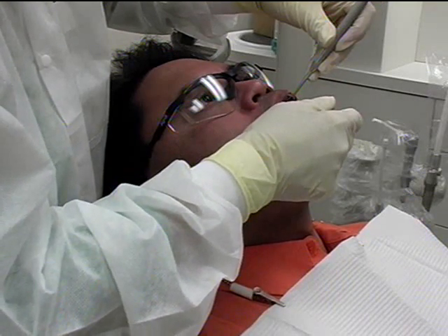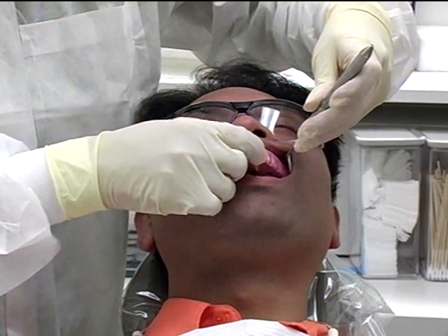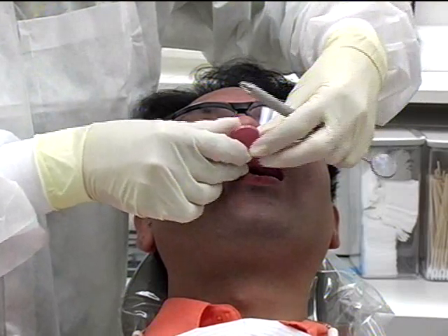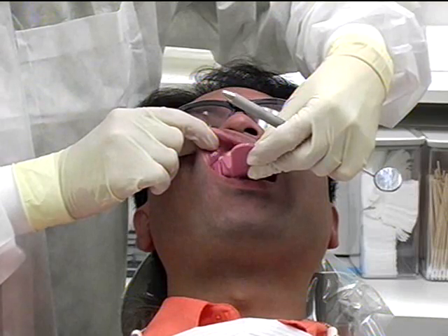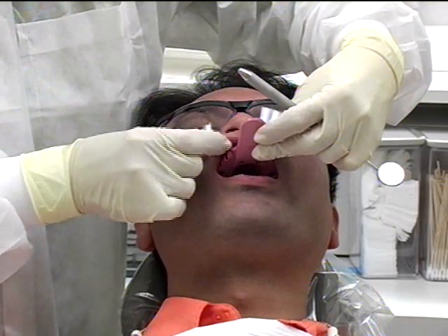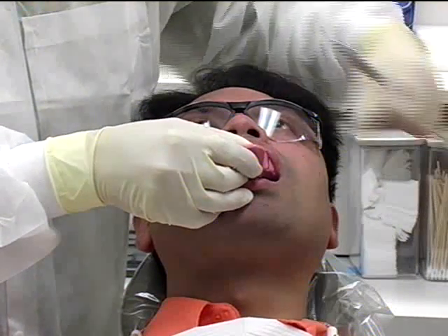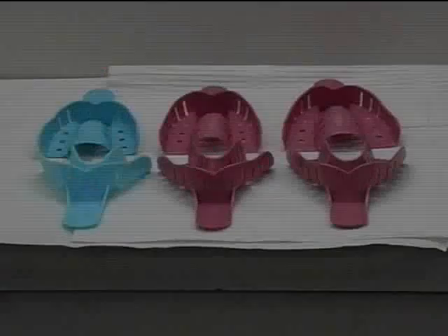Now check for the proper extension of the tray. The posterior end of the impression tray should be just distal to the maxillary tuberosity. The anterior portion of the tray should cover the anterior teeth, with the incisal edge and cusp tips contacting the flat arch portion of the tray, about 6 millimeters from the raised flanges.